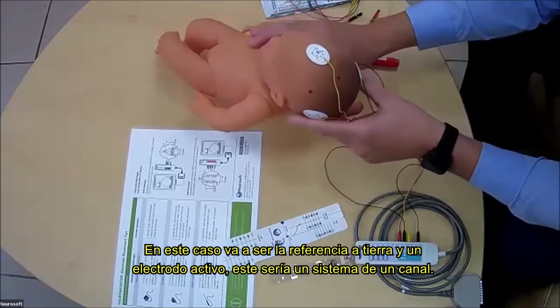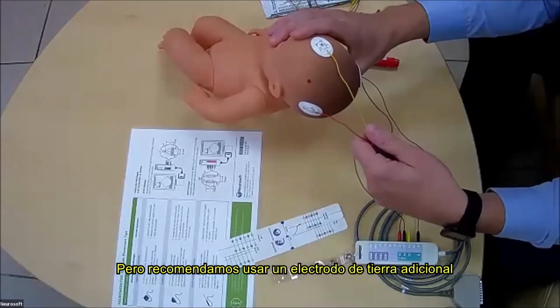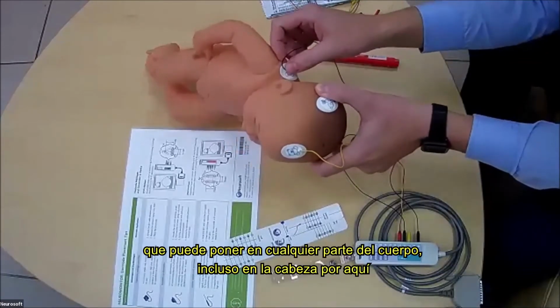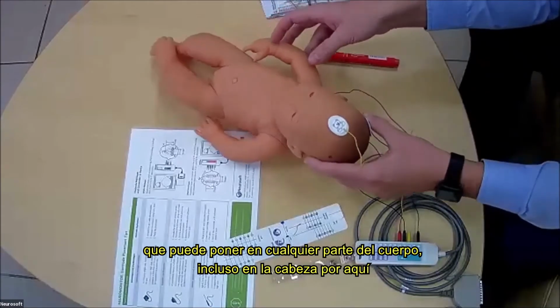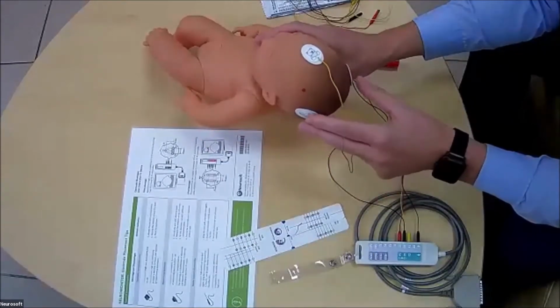So using this strip, we can easily put electrodes, and here we can use only 3 electrodes. In this case, it will be ground, reference, and active electrode. This is a one-channel system, but we recommend using an additional ground electrode, which you can put on any part of the body, even on the head, also here. And with the help of this electrode, we can record even 3 channels.